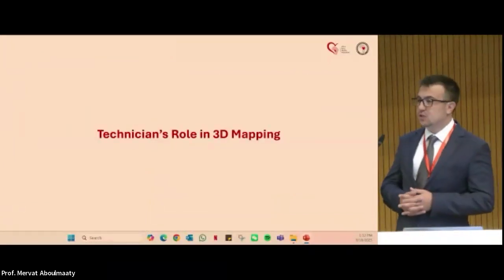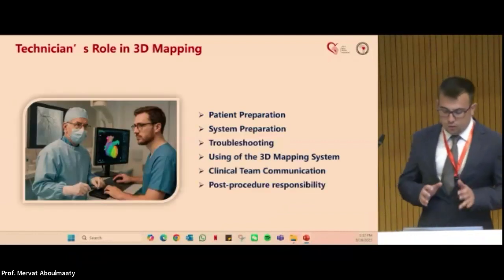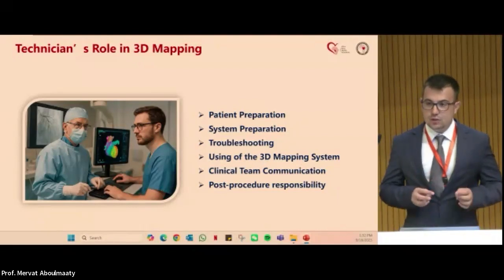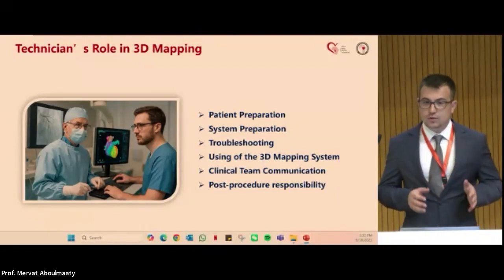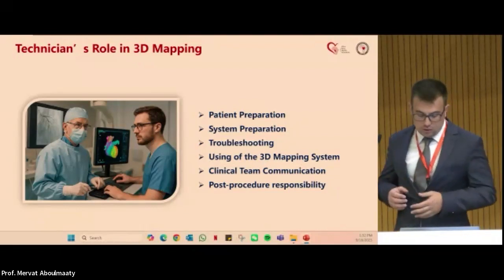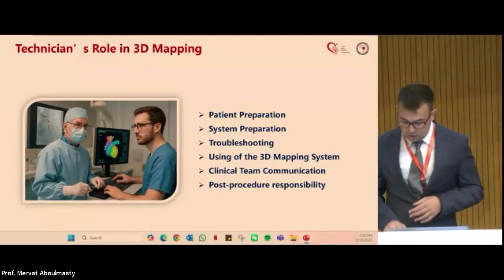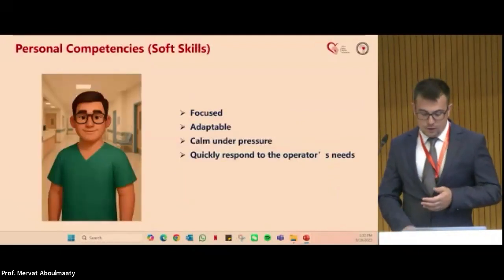What is the technician's role in 3D mapping procedures? First of all, patient preparation, system preparation, troubleshooting, which is very important, using the 3D navigation system, clinical team communication, and post-procedure responsibility are the technician's role. So what are the soft skills?